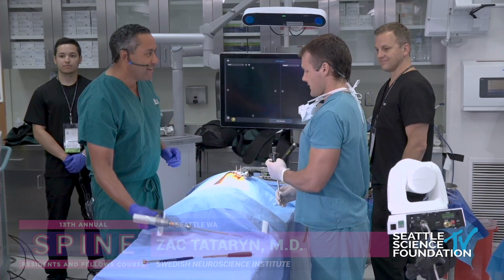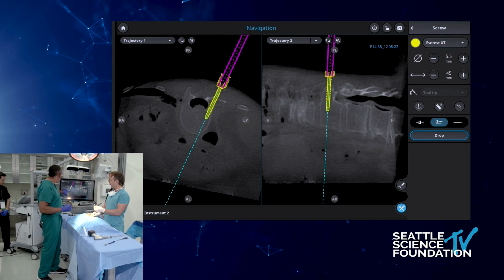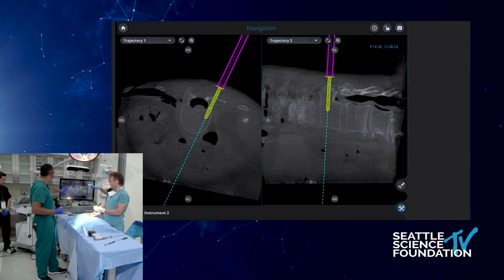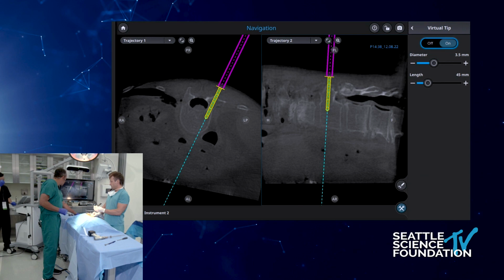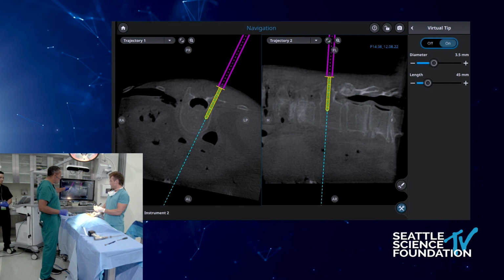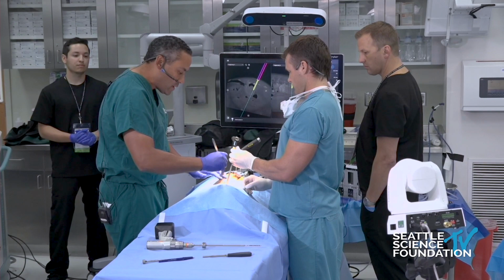This is how this works. The great thing about this is that we can mock up a screw, but we don't actually want the screw. We just want that. That's all we want. So this thing is showing me a 50 or a 45 millimeter tip extension off of this instrument. And so this is how I know where to make the skin incisions. You can see we're right here on the skin. And this thing is telling me that if this is where our stab incision is, then we're in a great situation to dock onto the bone.